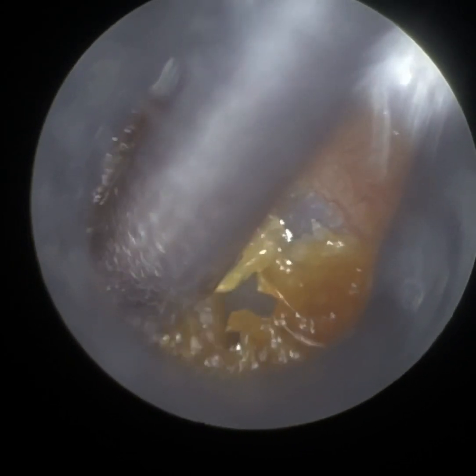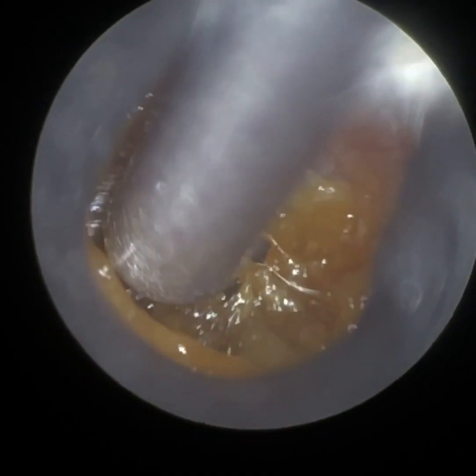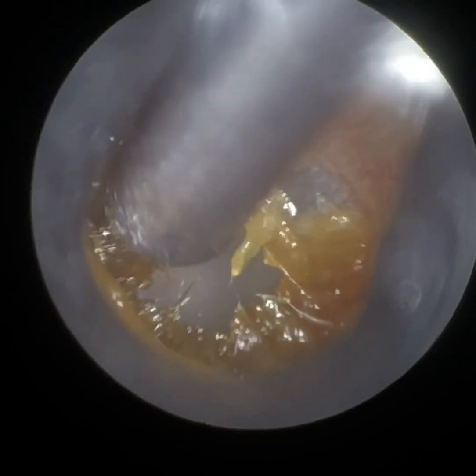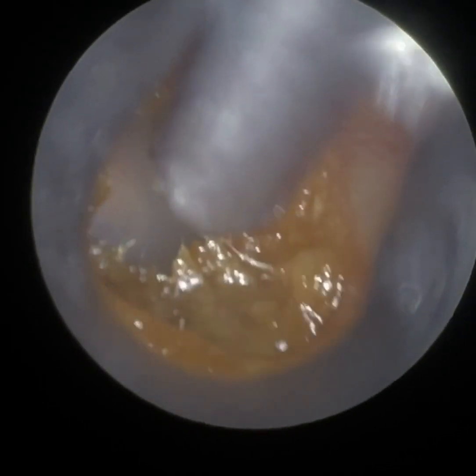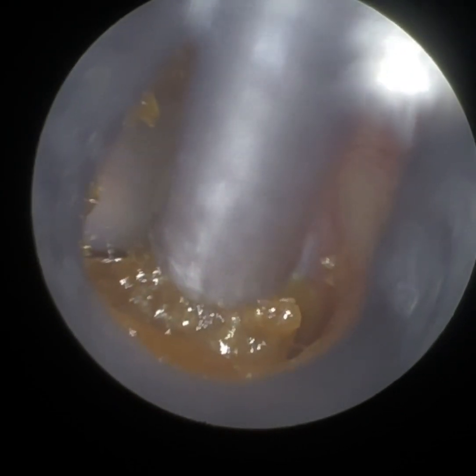As we approach the eardrum, the ear canal narrows and then widens. Once it widens again, it creates an alcove to the front part of the ear canal near the eardrum called the anterior recess, and quite often you can get wax impacted there. Also in this region, this is called the inferior recess.